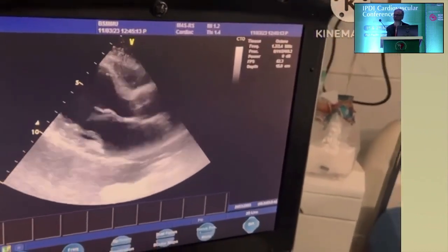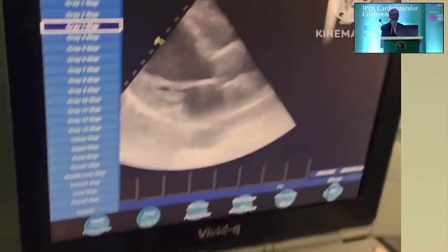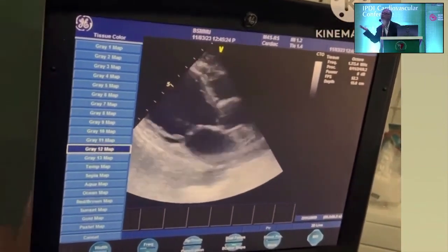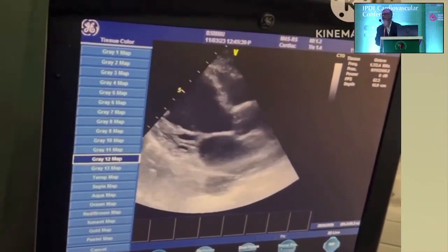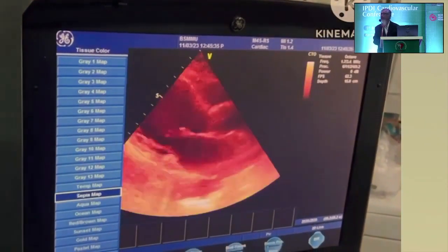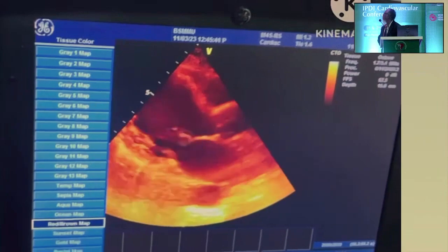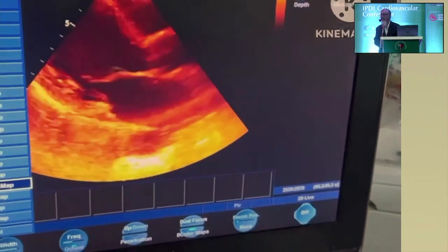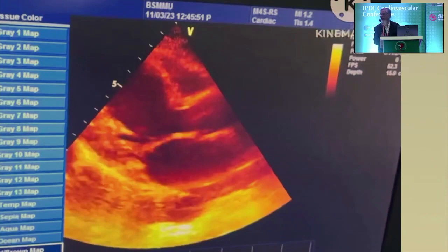Unfortunately, you would have enjoyed the video, the version that they made. These are the color scales. Please look carefully at the changes in the myocardium as well. Please concentrate on the posterior and the anteroseptal wall. With each change of the color, you will find some difference. To him, the anteroseptal wall was much more visible with changing the color. I found the grayscale in between very attractive, as a matter of fact.